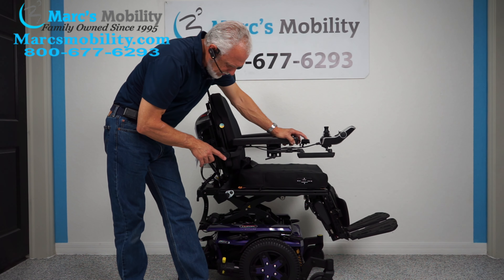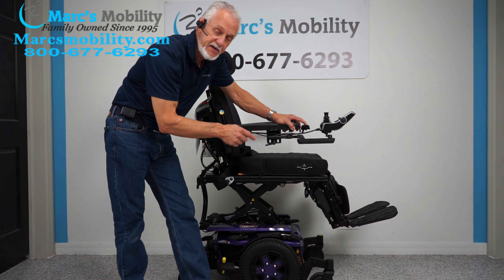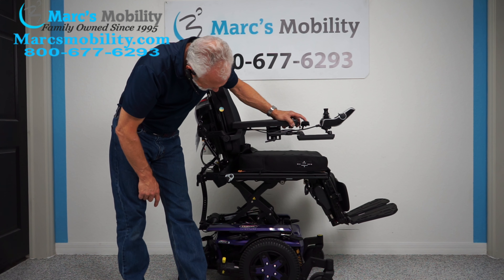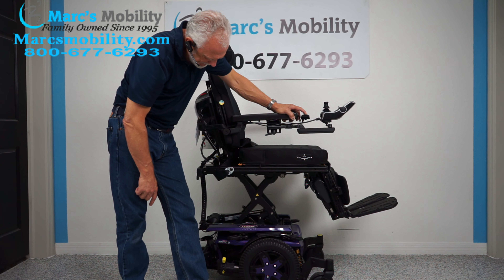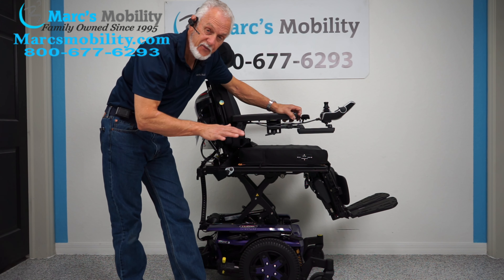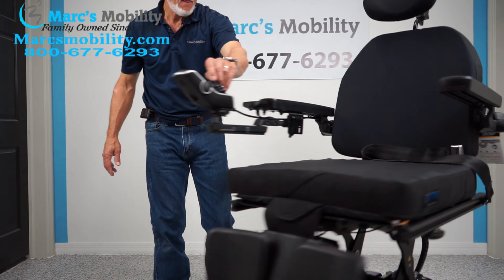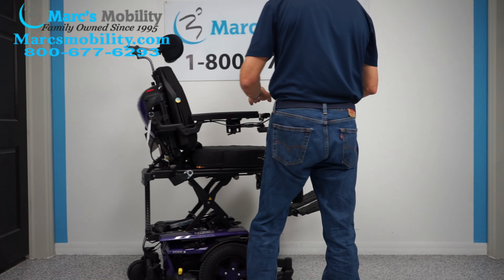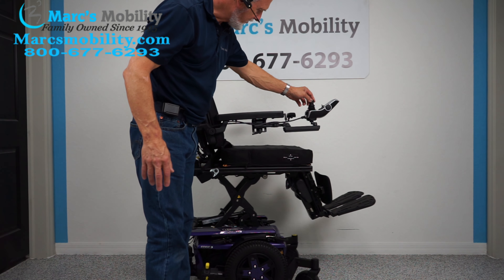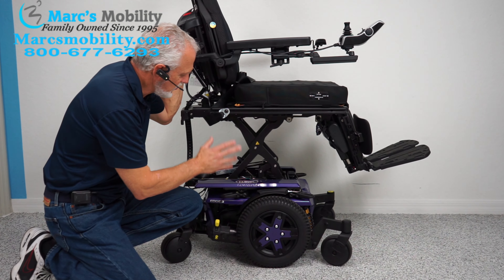You're going to start at roughly 22 inches when you're down, and by the time the seat is all the way up, it'll be at 34 inches. The nice thing about this chair is that once the seat is elevated all the way up to 34 inches, this chair will still drive. You have to keep your finger on the button because as soon as you let go, it stops going up. It'll drive at 3 to 4 miles an hour. I can't show you in here, but I'll show you when we go outside.